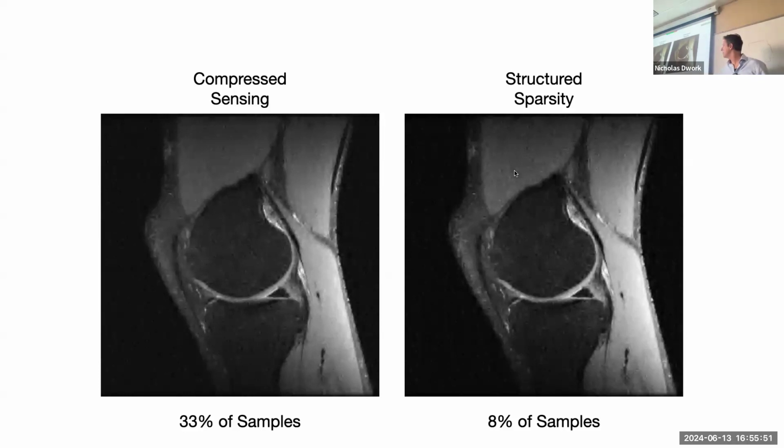And maybe that'll help. I've also combined this. Here I'm showing you just the wavelet transform, but I've done this with an overcomplete dictionary using both the wavelet and curvelet transform. And you could extend that as much as you want, adding as many dictionaries as you want. That'll help eliminate this a little, I think.